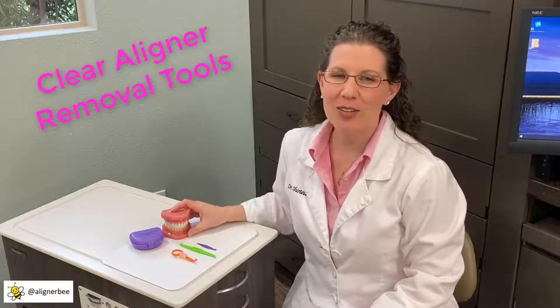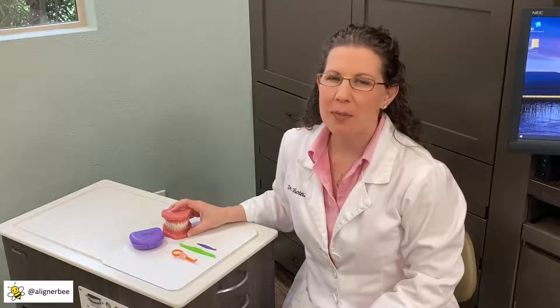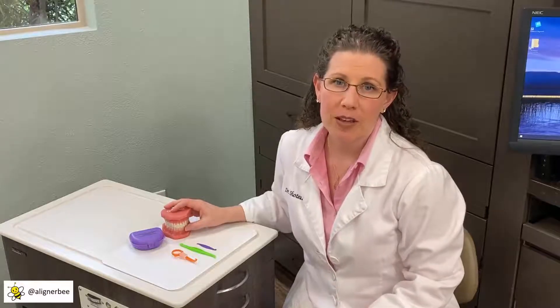Hi, this is Dr. Melissa Chotel, also known as the Aligner Bee. One of the many challenges that some of my patients face when getting used to wearing their new aligners is how to remove the aligner from the mouth quickly and easily before meals or when they're out and about.